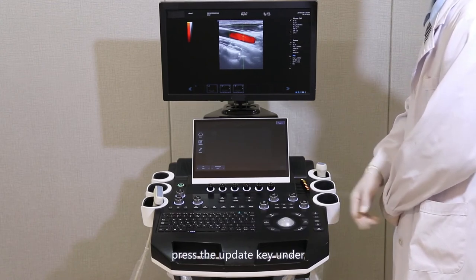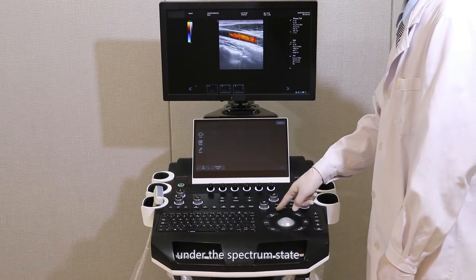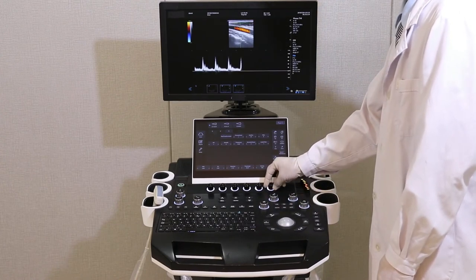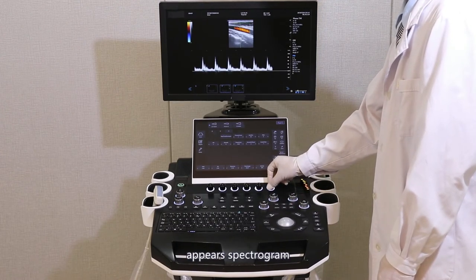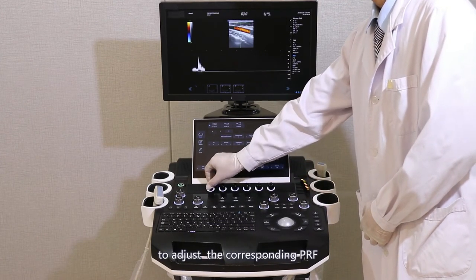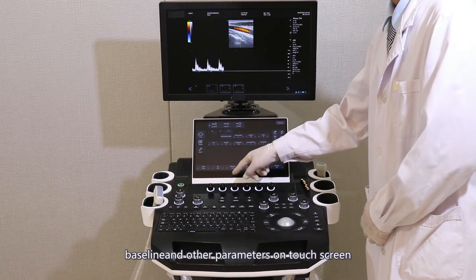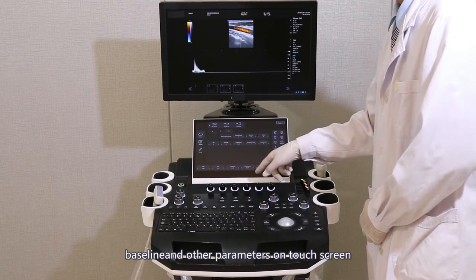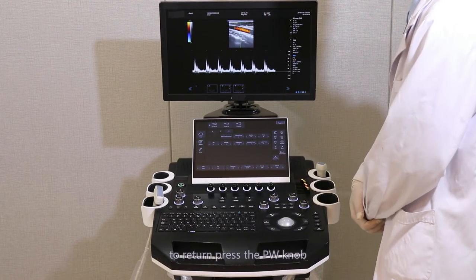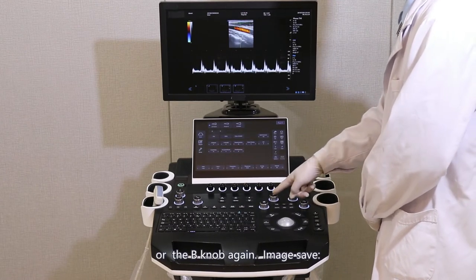Through the corresponding spectrum angle knob on the touch screen, adjust the sample angle to about 60 degrees. The sample angle should be parallel with the vessel wall. Press the update key under the spectral state to display the spectrogram. At the same time, adjust the corresponding PRF, baseline, and other parameters on the touch screen to get a better spectrogram display. To return, press the PW-knob or the B-knob again.